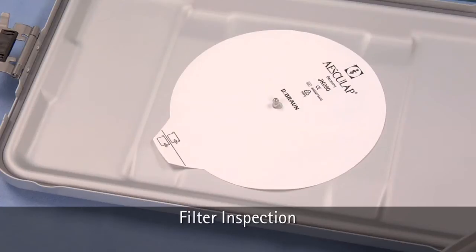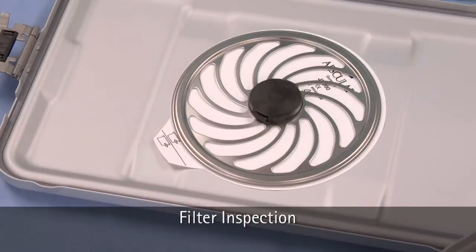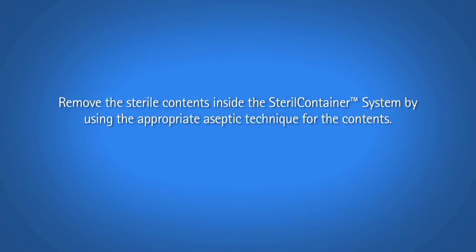Reinstall the reusable filter and reinstall the filter retention plate. The reusable filter is held in place so it does not get lost or discarded during transport back to sterile processing. Remove the sterile contents inside the sterile container system by using the appropriate aseptic technique for the contents.